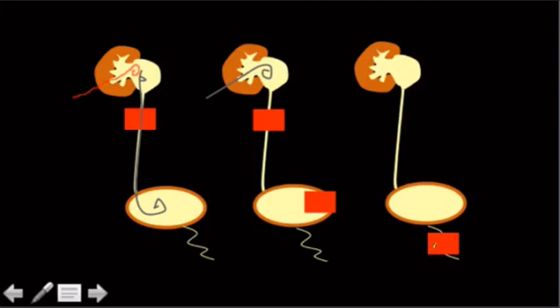All right, last situation is a guy with an outflow problem. So he's got BPH, maybe a neurogenic bladder, a big prostate cancer, or a urethral injury here. So this is a guy that would be a good candidate for a cystostomy tube. This works fine, this works fine, this works fine, he just can't get out of the bladder, so we'll drain out that way. All right, there you go.